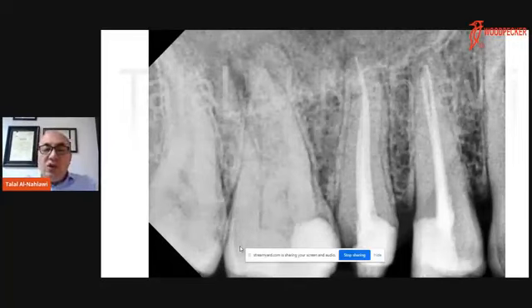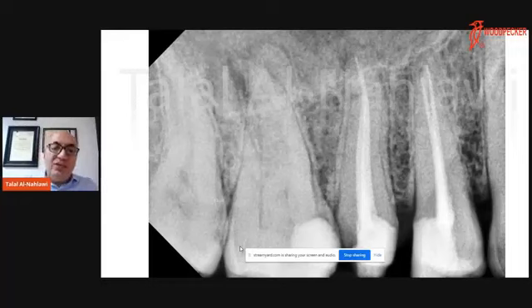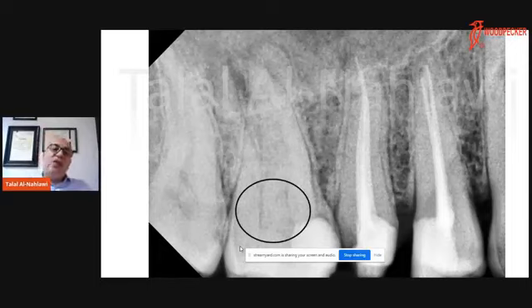Another application also, if you have a huge calcification of the pulp chamber, the T3 works perfectly in the coronal part. You can use it, but again I have to emphasize a very important issue. Magnification is very important. You can use the loupes, because nowadays in dentistry we no longer accept blinded dentistry. We have to see to understand more how to perform endodontics in a better way. So it is good to use the loupes, and as you can see, to focus more on this X-ray of the upper first molar, which was suffering from pulp necrosis.